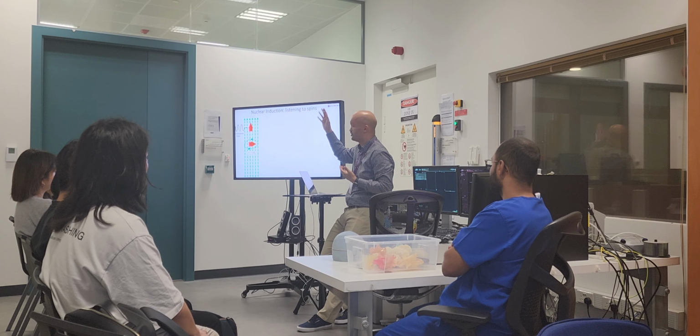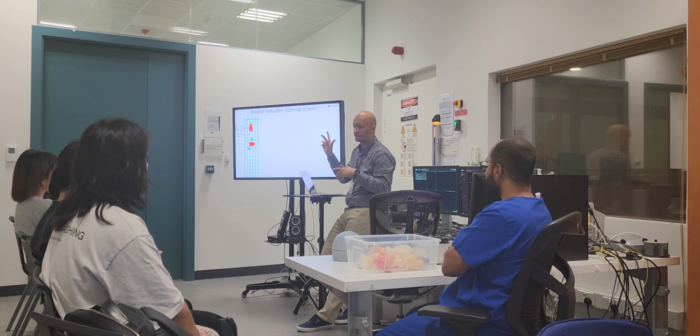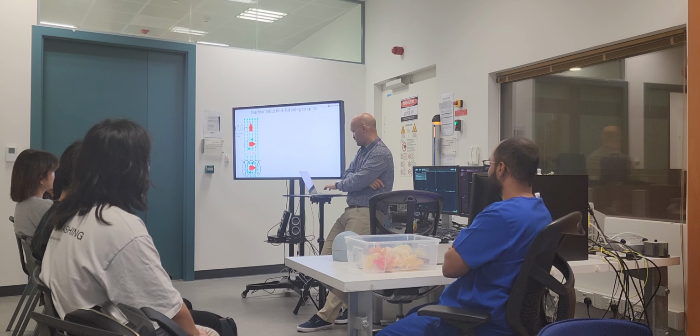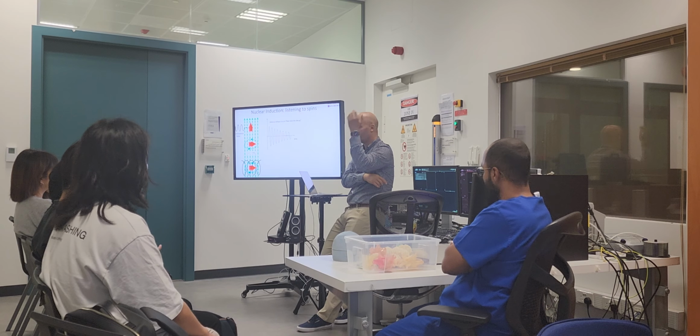It's experiencing a B0, and you talked about the Bloch equation, gamma M0 cross B. So it's a cross product. As long as the magnetization is perpendicular to the magnetic field, it will do angular momentum. It's going to come back. As it's coming back, it's relaxing, right? It's a little magnet precessing in an antenna, and that generates through nuclear induction a voltage. That voltage has an oscillation frequency, and it decays when magnetization comes back to equilibrium, right?